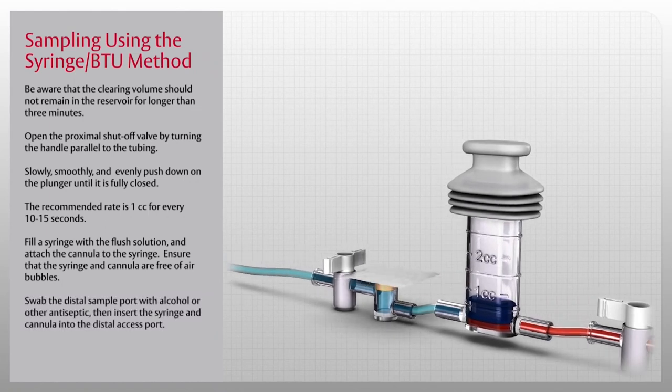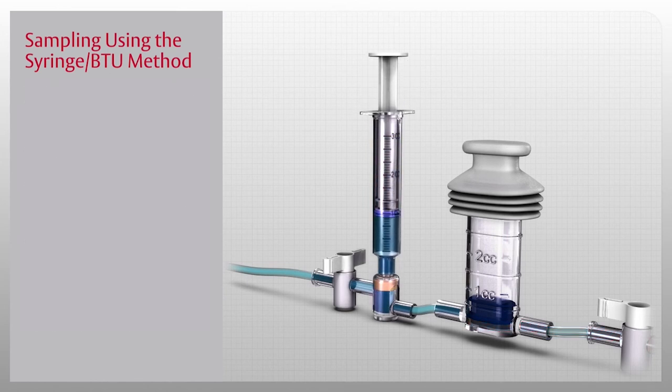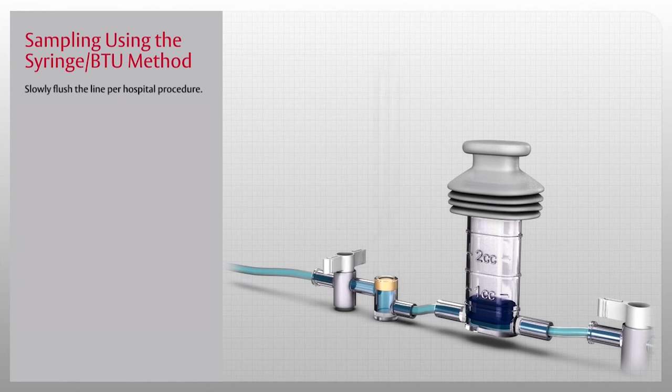Swab the distal sample port with alcohol or other antiseptic, then insert the syringe and cannula into the distal access port. Slowly flush the line per hospital procedure.